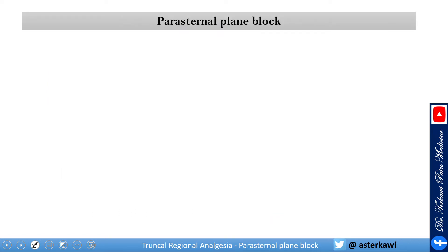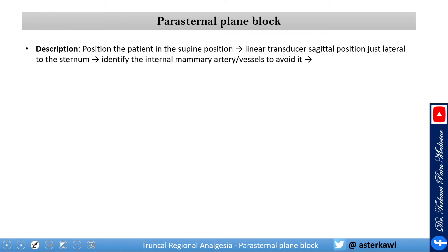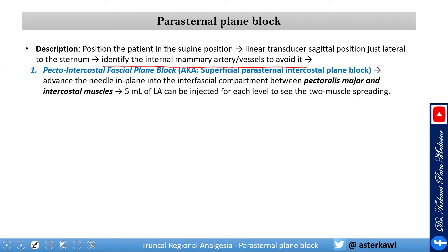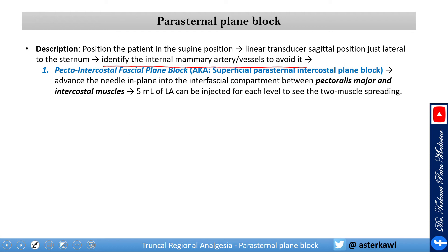To perform a parasternal plane block, position the patient supine, use a linear transducer, and place the probe in a sagittal position just lateral to the sternum. It is important to identify the internal mammary artery and vessels to avoid injury. There are two approaches: superficial and deep. The superficial approach, also called the pecto-intercostal fascial plane block, involves advancing the needle in-plane into the interfascial compartment between the pectoralis major and intercostal muscle. Inject 5 mL of local anesthetic and watch it spread, separating the two muscles.